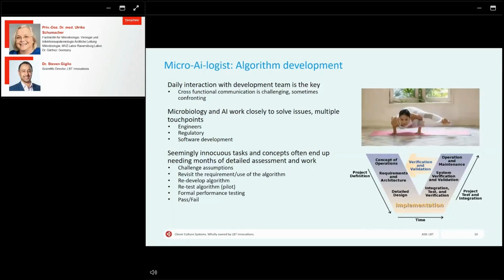You can't actually predict how the system works unless you test it. So you have an idea of how it would work, but unless you do some very specific testing, you can't prove that the technology works. And it's a really important point. It's not something you could just go onto Google AI and really try to test. There are very specific ways to do this, and also a lot of regulation around that.